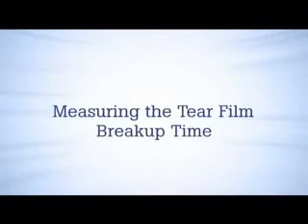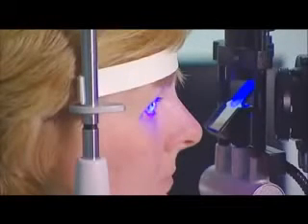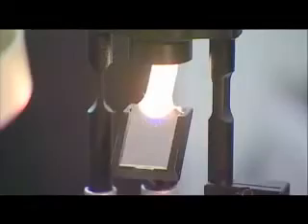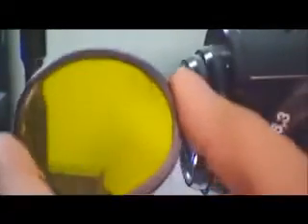Measuring the tear film breakup time. Each eye is examined using the blue exciter source of the slit lamp. A yellow absorption filter placed over the slit lamp objective, e.g. Wratten 12, enhances fluorescence, and allows grading to be performed on both the cornea and the conjunctiva.